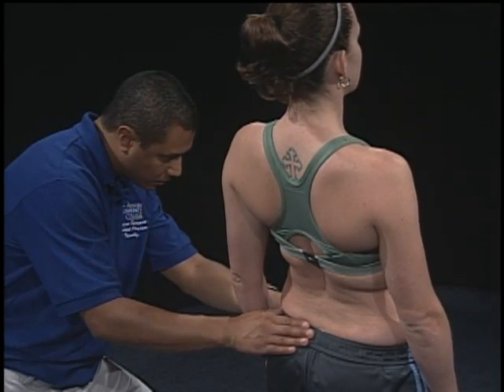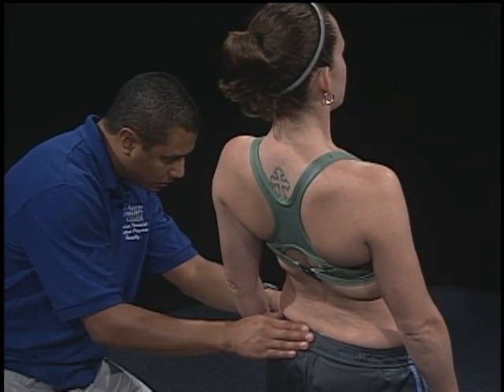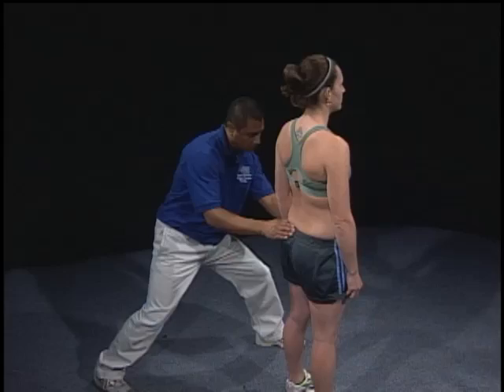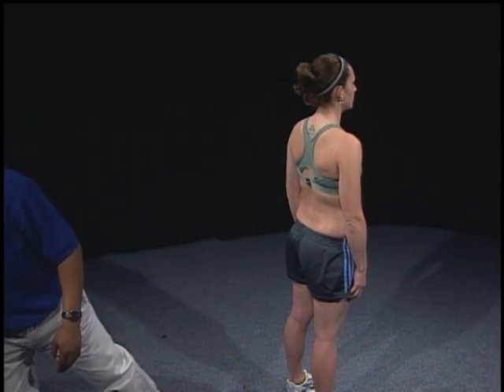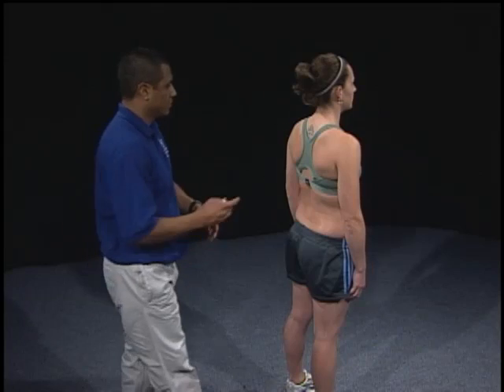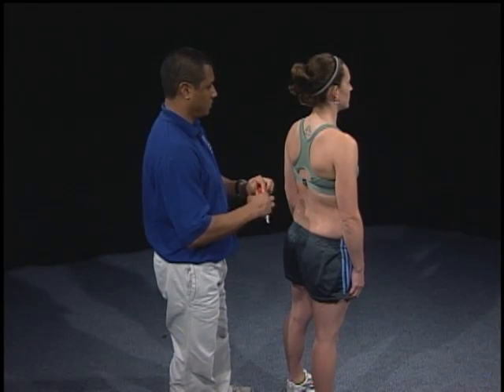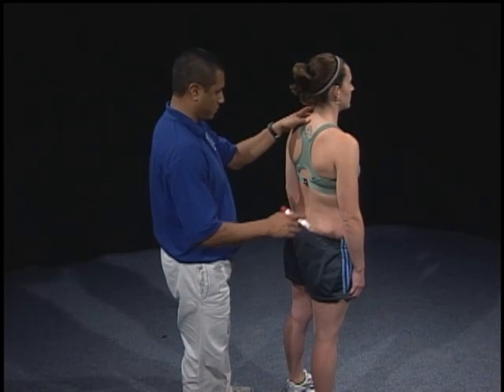Palpate the pelvis for posterior tilting. Passive movement is generally not assessed due to the difficulty in moving the patient through full range of motion of the spine. The end of thoracic and lumbar extension range of motion occurs when resistance to additional extension is felt by the patient and the examiner feels the pelvis start to tilt posteriorly.